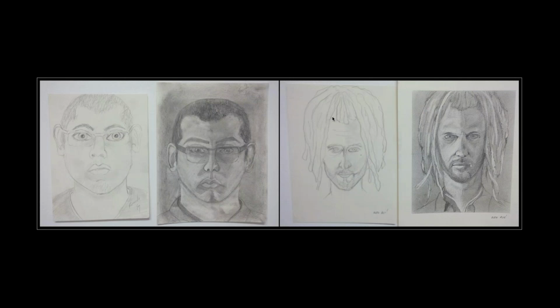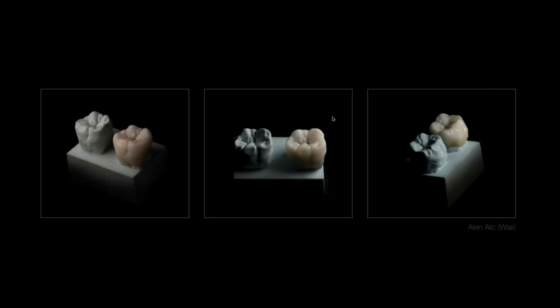I mentioned it because it helps me a lot to transfer that knowledge to my profession, to waxing up. And when you learn these skills, it's much easier for you to do the wax-up more closely to nature. Okay, so basically this is what we did after that course. We copy the natural tooth, and it's all in wax.